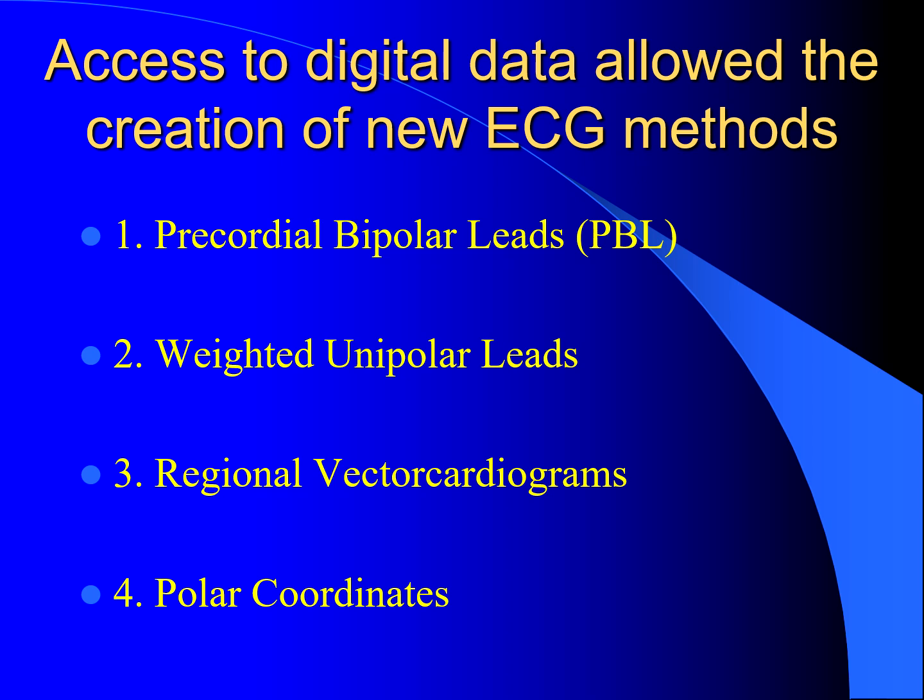This new method consists in the creation of precordial bipolar leads, weighted unipolar leads, regional vectorcardiograms, and polar coordinate representations.